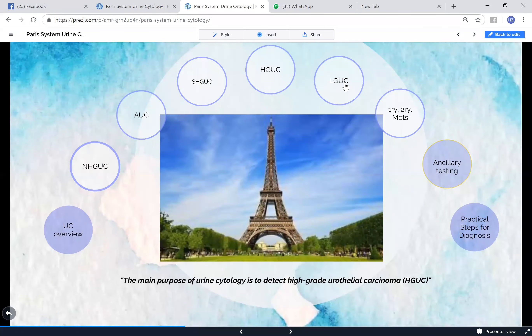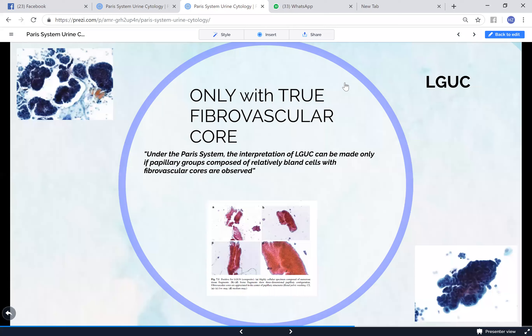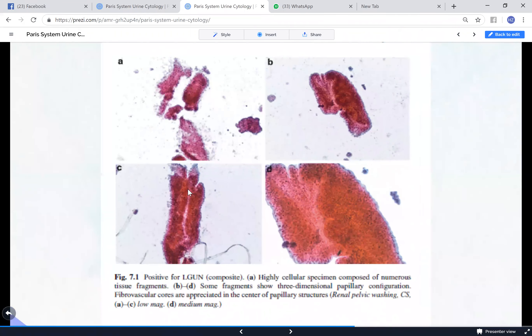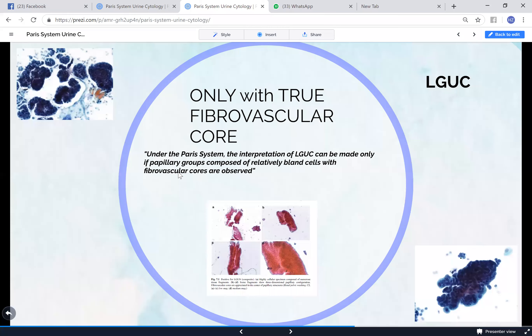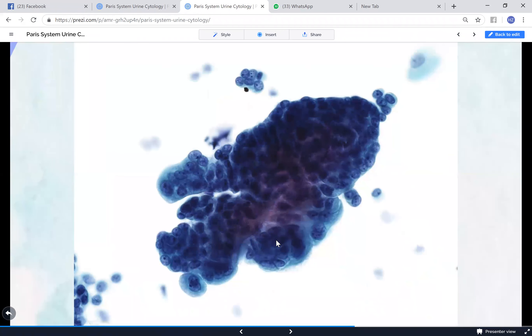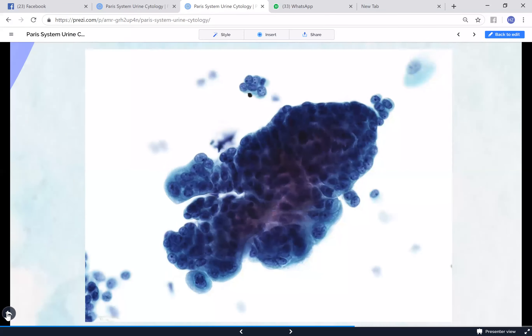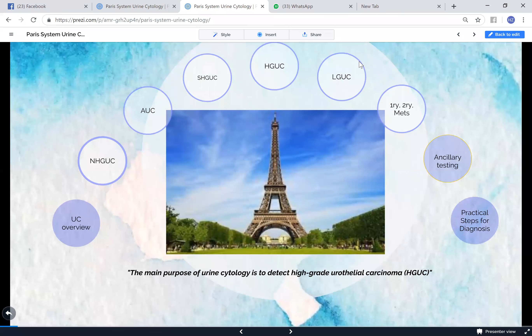Low-grade urothelial carcinoma is unique in the Paris System because you can only diagnose it if you actually see a fibrovascular core. This is extremely rare to find - most of the time you will see tissue fragments that, if they meet criteria for atypia or suspicious for high grade, will fall into those categories. If you do find a fibrovascular core, then yes, you can place it in the low-grade category.